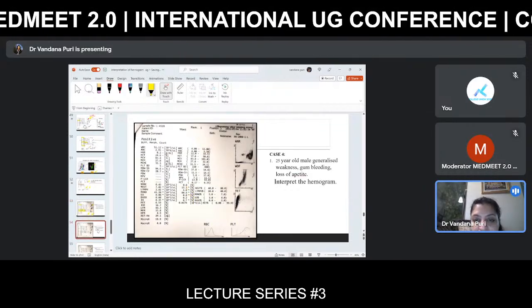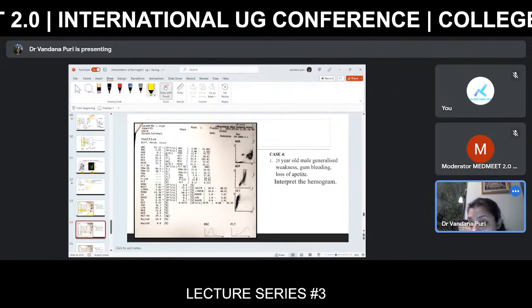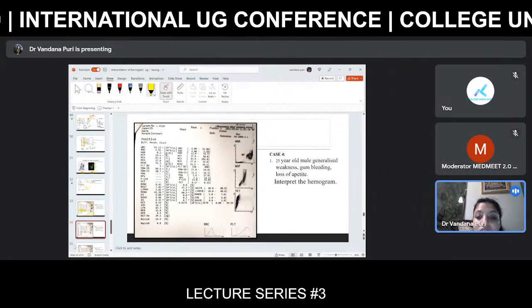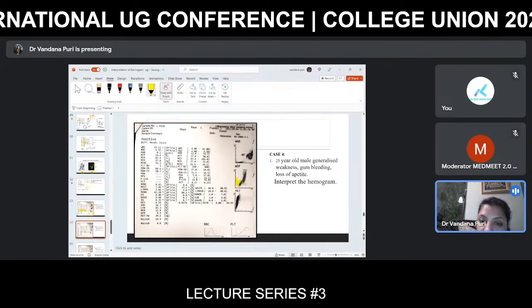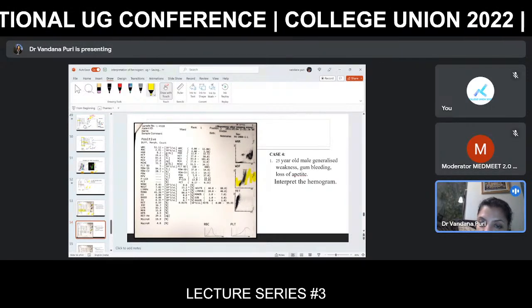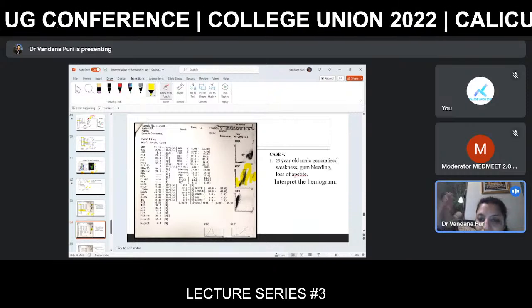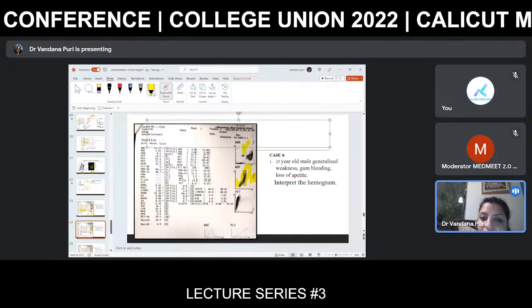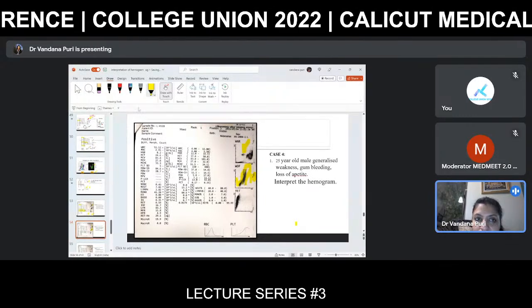Whereas if you look at this case here, what catches your eye is that instead of the curve that you saw previously, here you can see this is lymphocyte and only monocytes are getting increased. There's no increase in the neutrophil. So probably monocyte is going in the abnormal peaks here. And again, there are nucleated RBCs, and your counts are increased. Your WBC is very high.